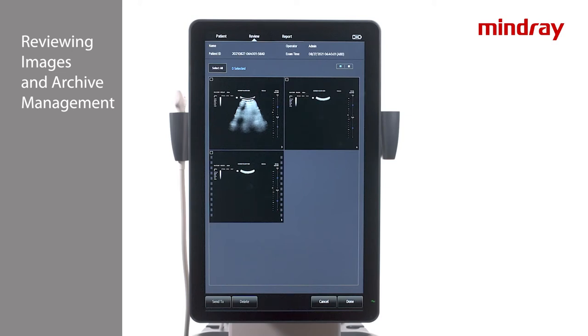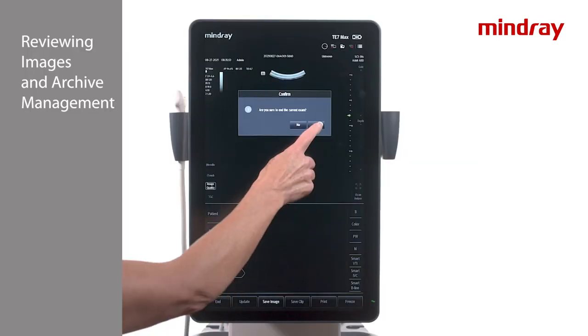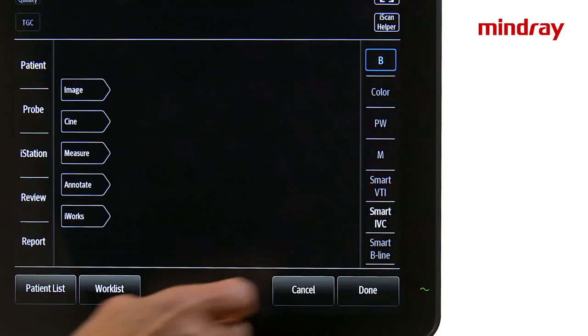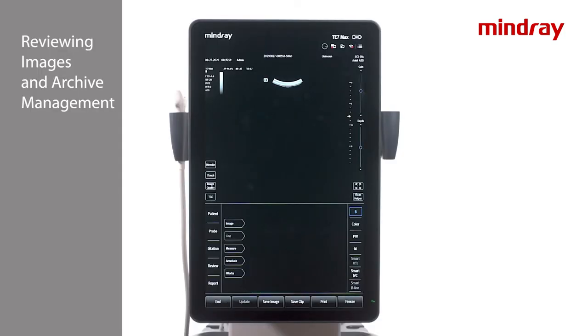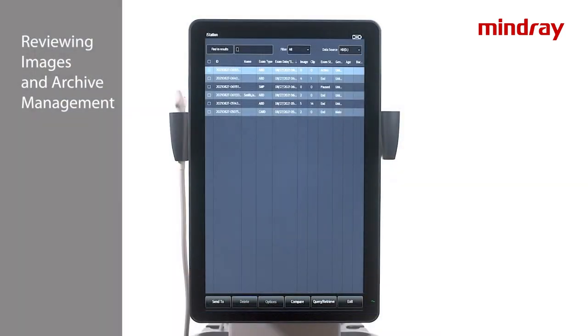Once all necessary changes have been made, select Done to exit review mode and return to the main imaging screen. Select End Exam. If the system has been set up to transmit images to a PACS, an application specialist may set up the system to automatically transmit images when selecting End Exam.